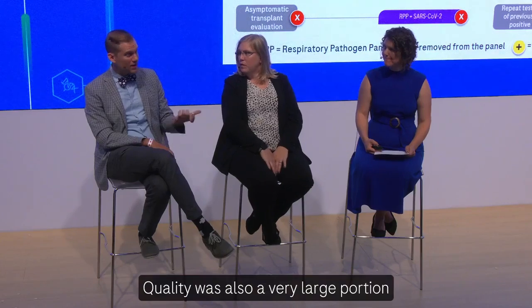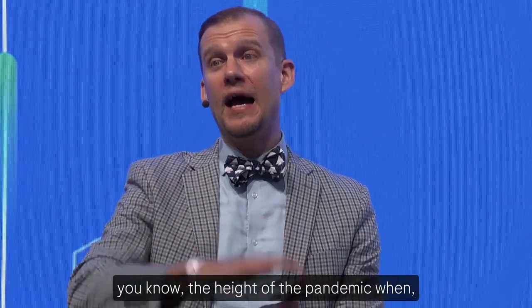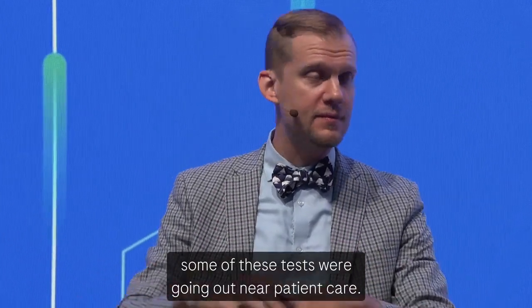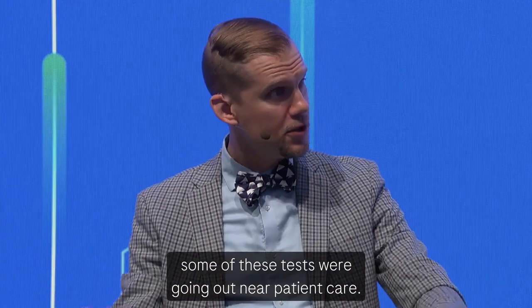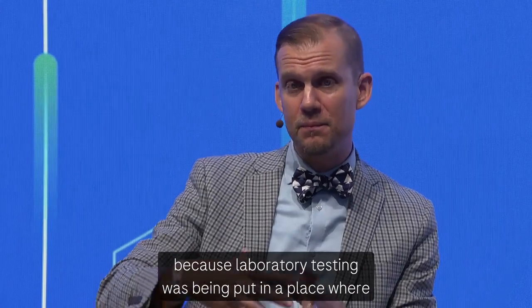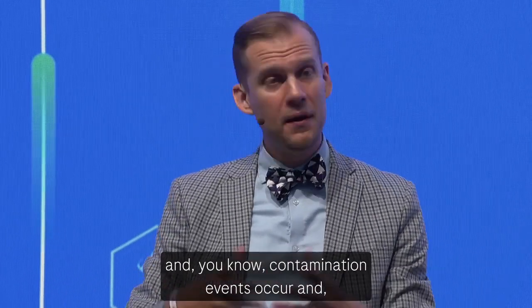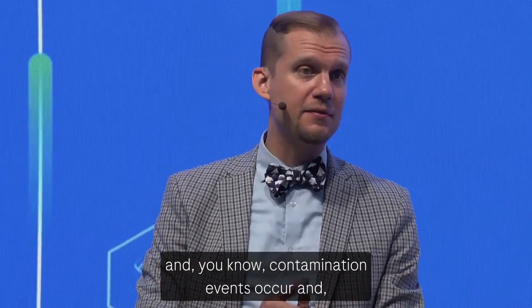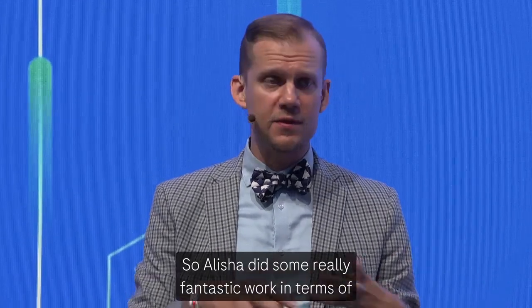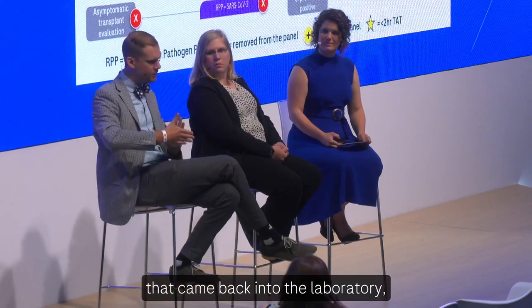Yeah. Quality was also a very large portion of some of these decisions at the height of the pandemic when everybody's just holding on, and some of these tests were going out near patient care. There were some quality issues because laboratory testing was being put in a place where people were not accustomed to laboratory testing, and contamination events occur, and that's something that we want to avoid. So Alisa did some really fantastic work in terms of teaching, so that we pulled back some of the testing, and that came back into the laboratory.